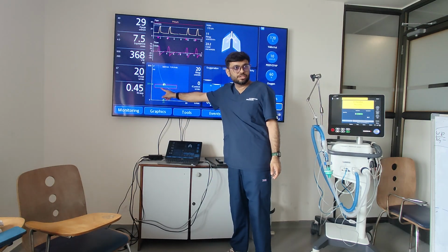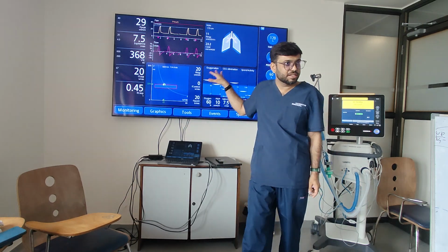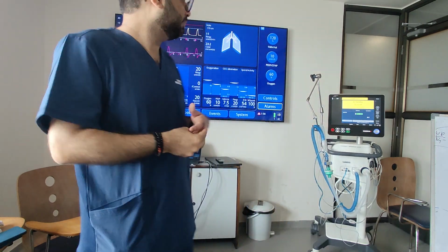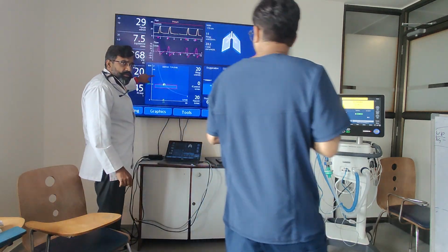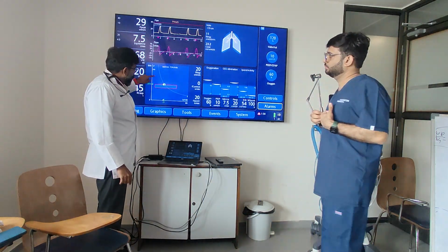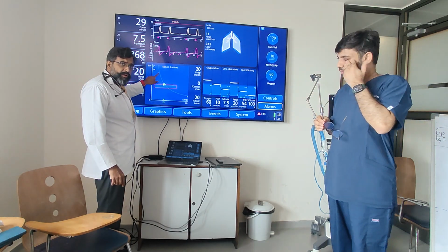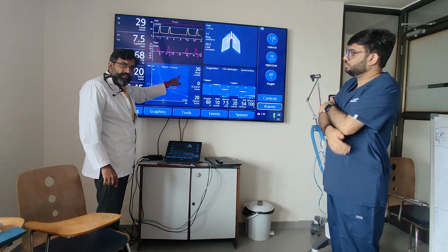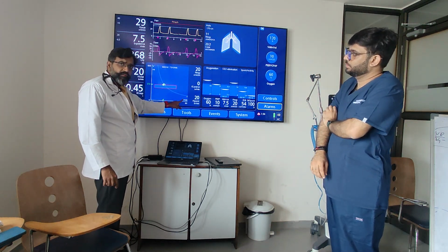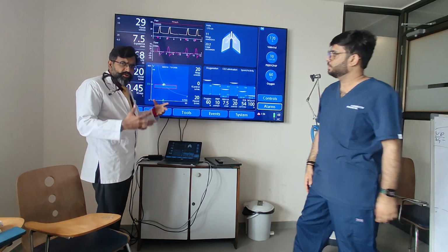Okay, this plus sign is your patient trying to meet the target. So this is your safety box here. Ideally this is a restrictive condition. So what happens is, say for example, your patient is here, it will try to move this patient by increasing the RR and reducing the pressures, reducing the volume. If the patient is here, it will do the opposite of that. If the patient is somewhere here, it will reduce the RR and increase the volumes. This is what it's going to do.